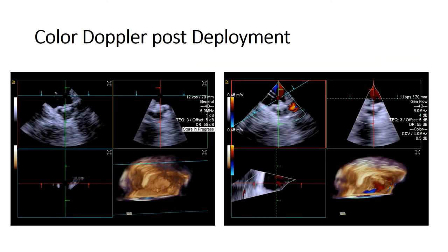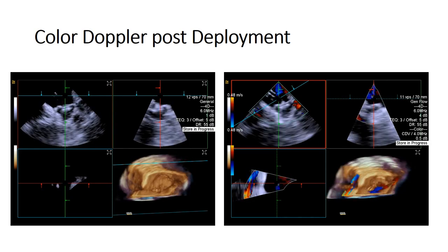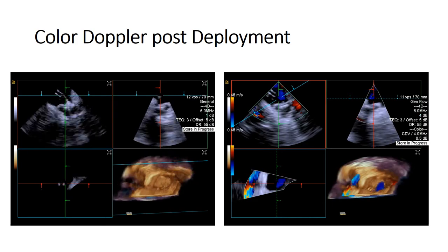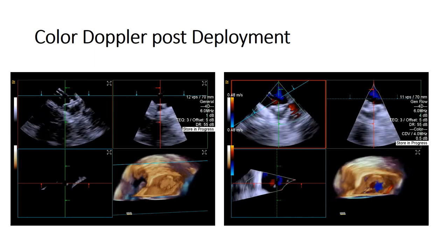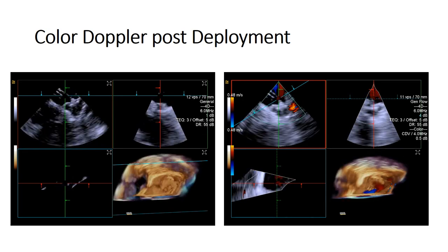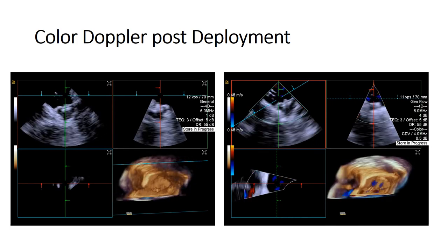Once compression rate measurements are complete, you can also use real-time 4D volumetric portrayal of the Watchman device from any desired rotational perspective to assess any peri-device gaps or leaks. These volumetric illustrations resemble conventional TEE views that confirm the PASS criteria at any 0, 45, 90, or 135-degree angles.